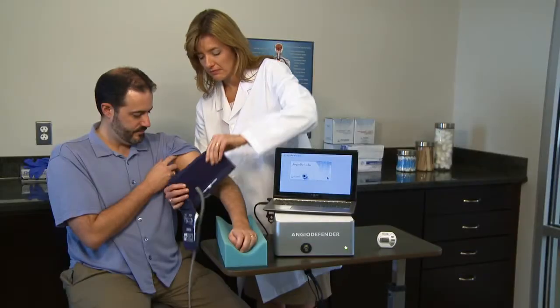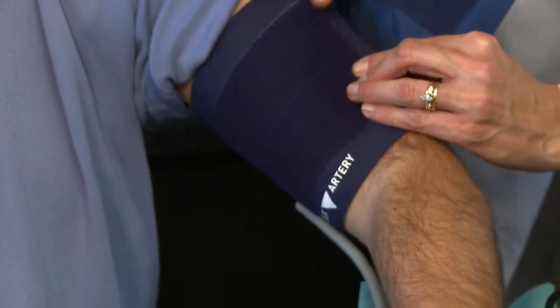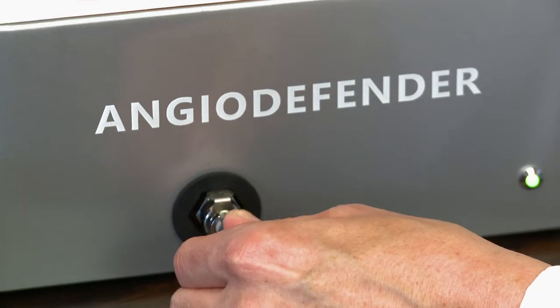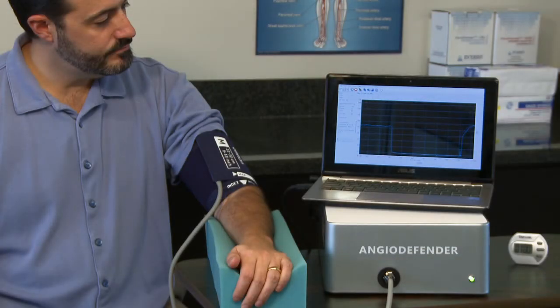Place the cuff on the patient's arm above the elbow. Make sure the index artery mark is within the range indicated on the cuff. The patient should be seated with the cuffed arm nearest the device.